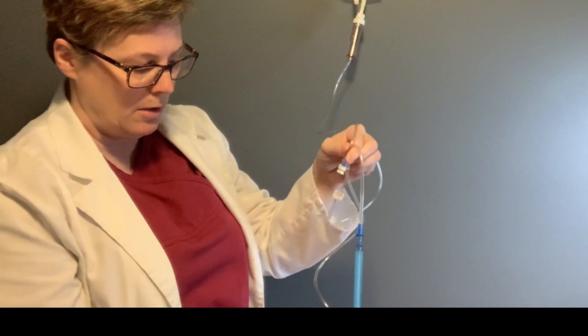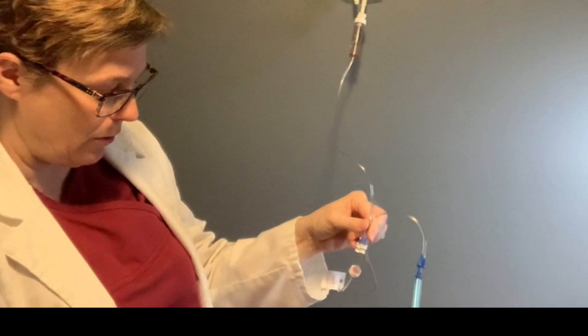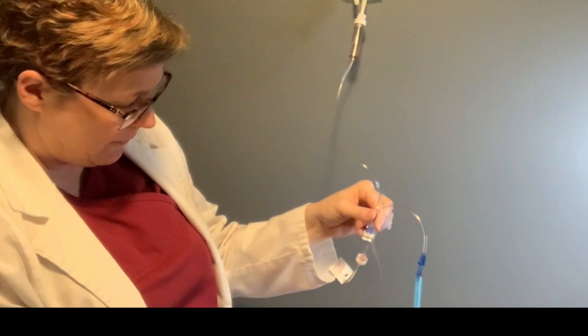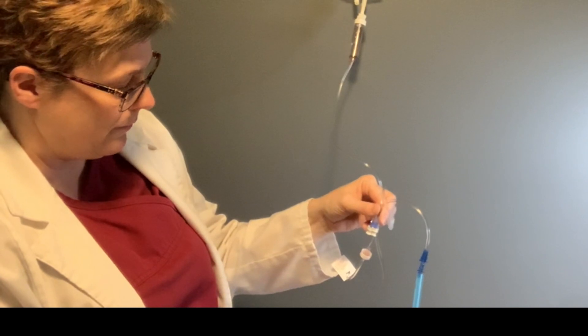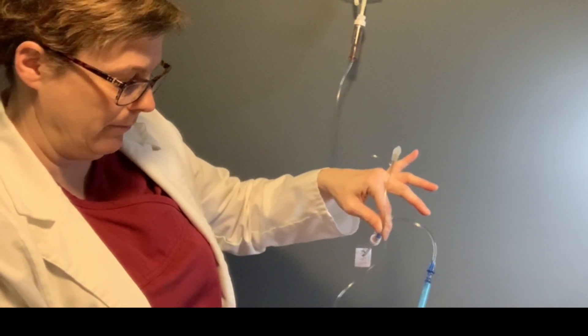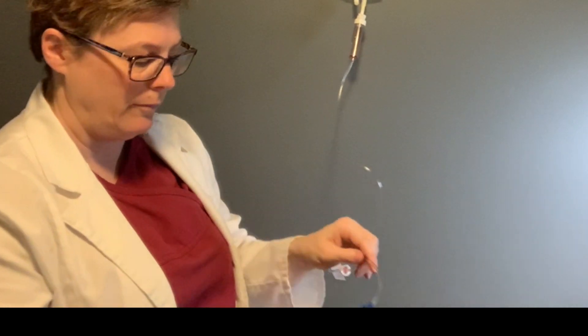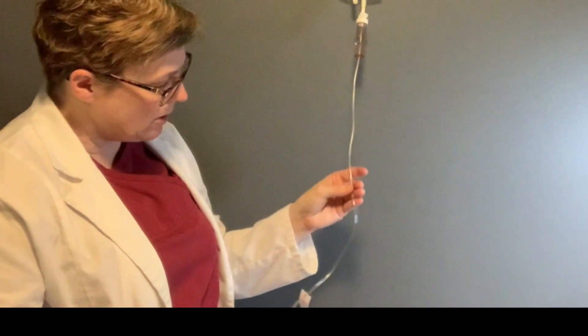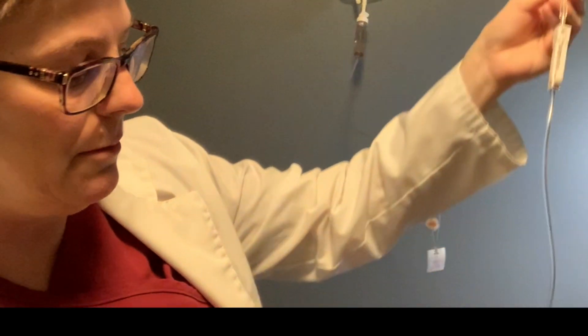Open up the clamp and you can see the fluid is now flowing through — and that one little bubble is already chased out. Final inspection, and this line is bubble-free.